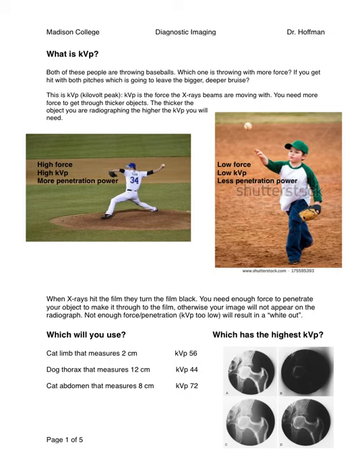So this is our very first topic of the semester. What is KVP and MAS? I'm going to go over this handout with you guys kind of quickly, but I do want you guys to take the time and really read it and understand it and digest it. You're going to have to look at this handout numerous times, read it several times, remind yourself of it several times. But the information in here really is key to beginning your understanding of what we're going to be doing in diagnostic imaging this semester.